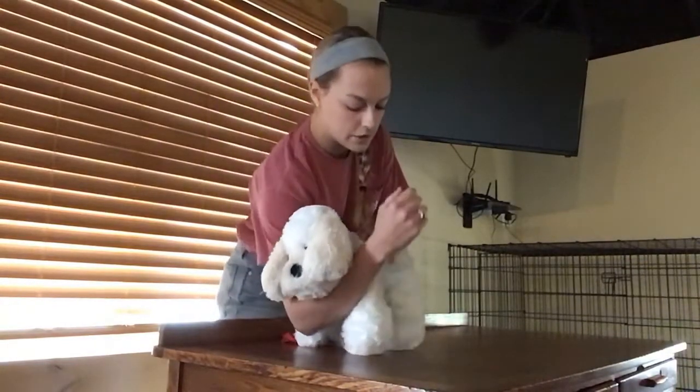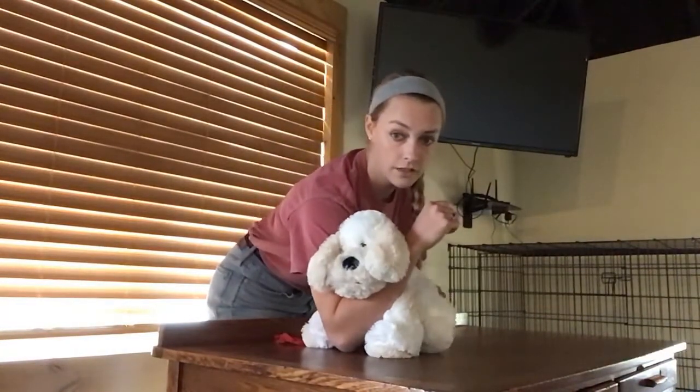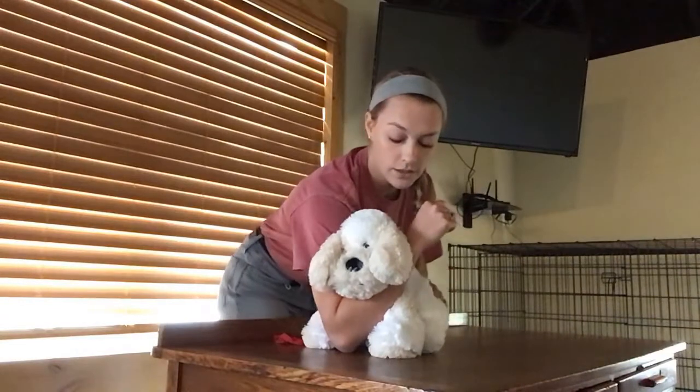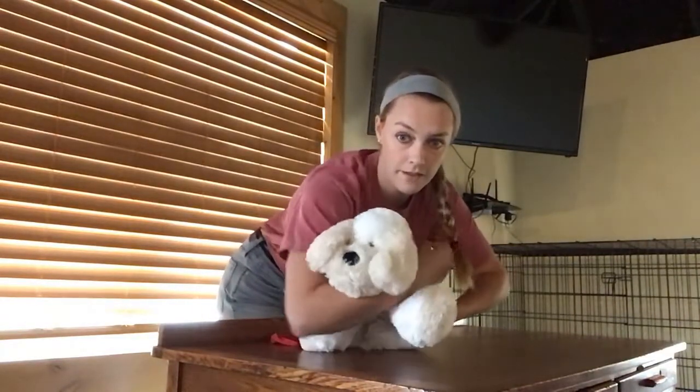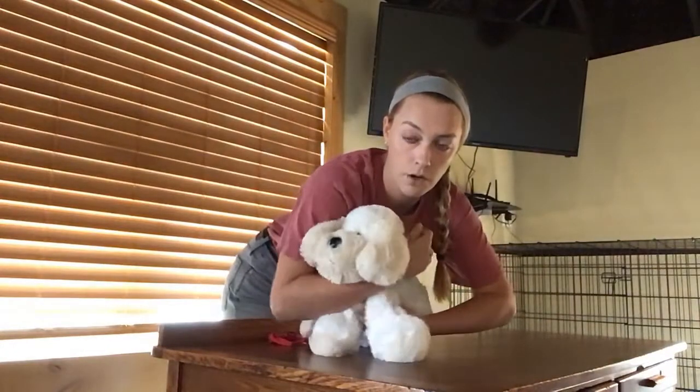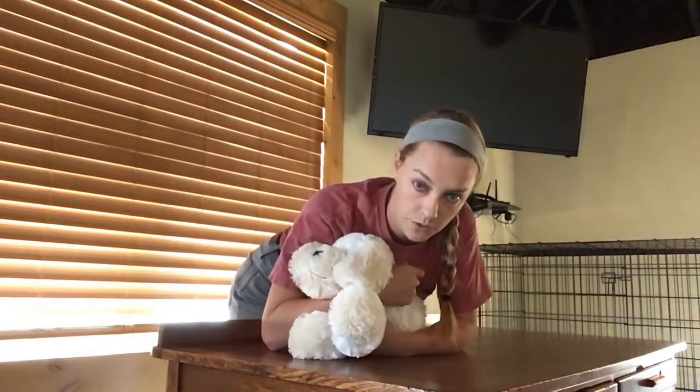I will go ahead and secure the head with my right hand. And then with my left hand, I can apply pressure that causes them to sit down. Once they're sitting down, again we need to get them into a lying position. I can use my left hand to grab both limbs and pull them forward while also applying pressure with my body.